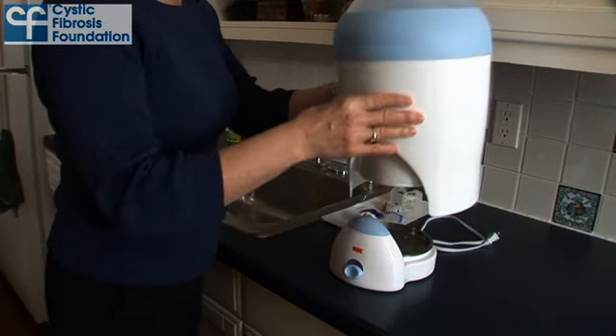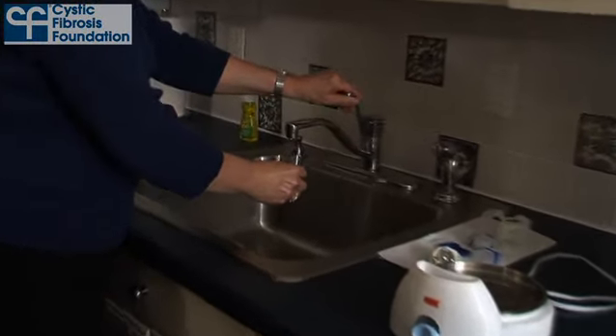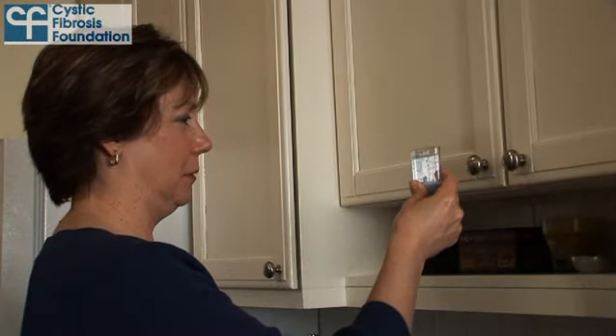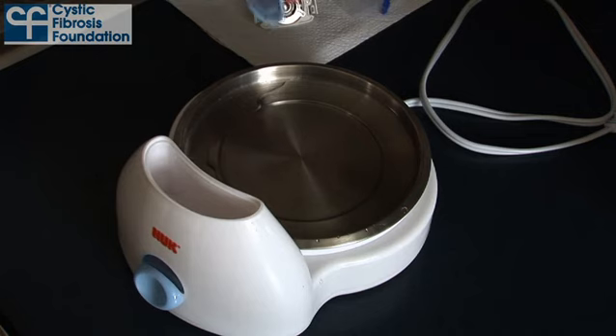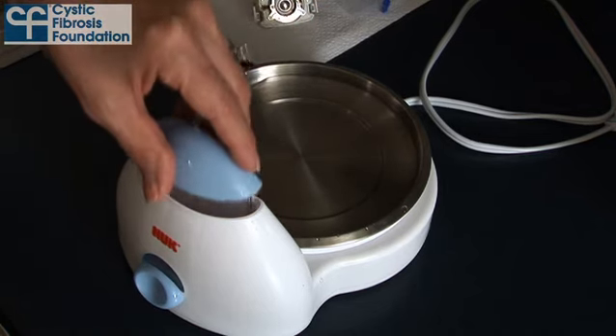Place the Nook base on a level surface and if you have children, be sure it's out of their reach. Remove the beaker from the base and use it to measure and pour 2.5 ounces of tap water into the base. You will need to use the beaker twice since the maximum measurement of the beaker is 1.5 ounces. After pouring the tap water into the base, replace the beaker in the holder.